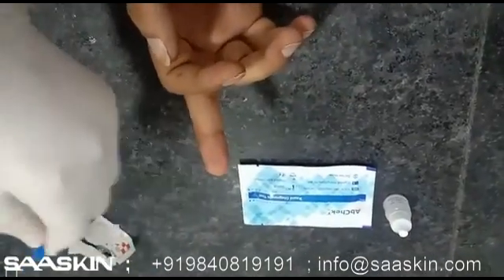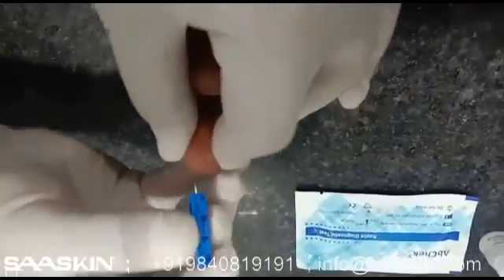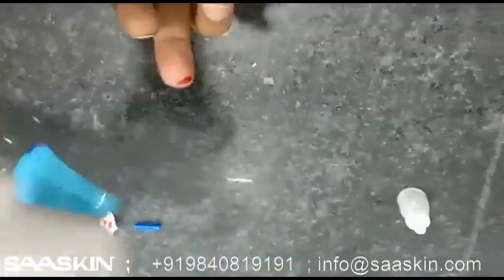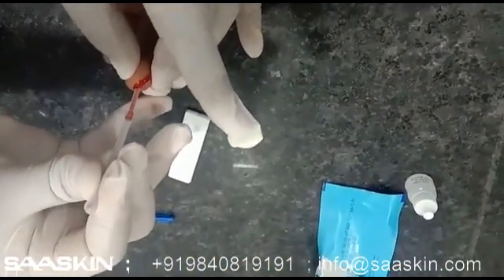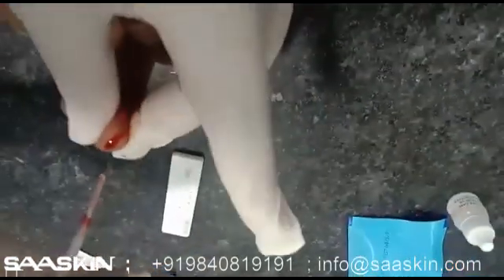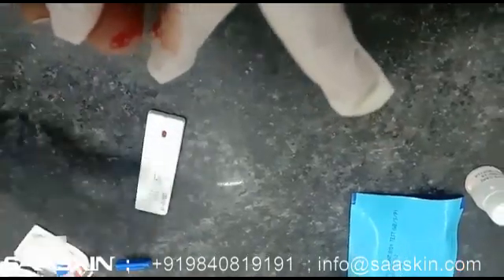Let it dry. With the help of the lancet, prick the finger. Take one drop of blood and dispense it on the sample well. Then add two drops of assay solution.